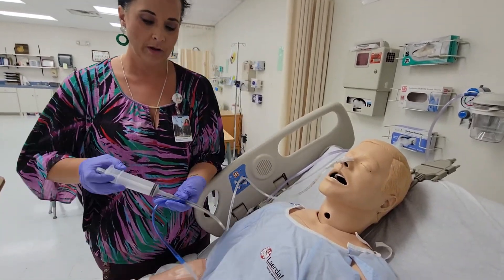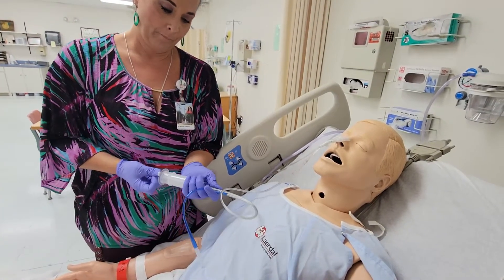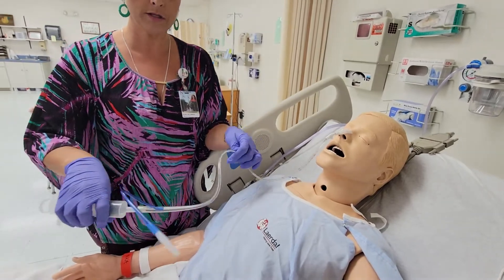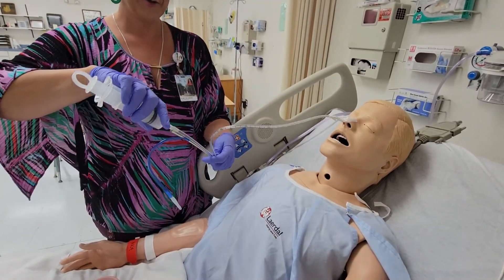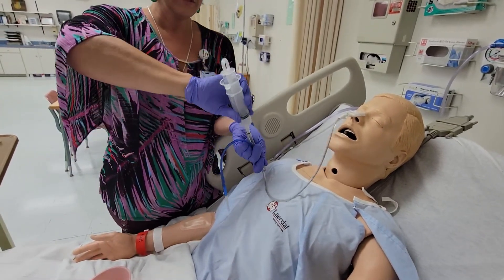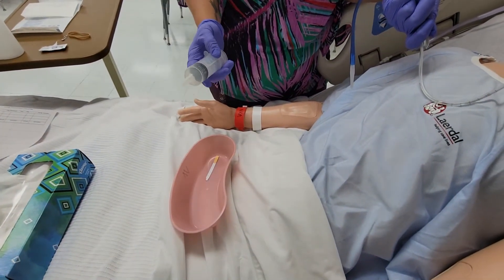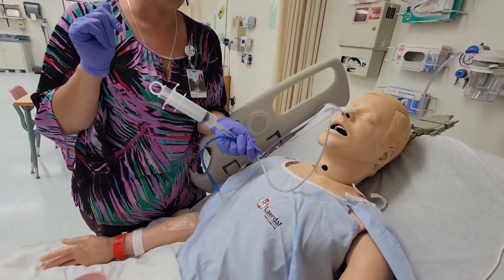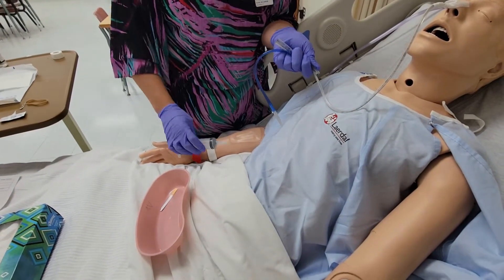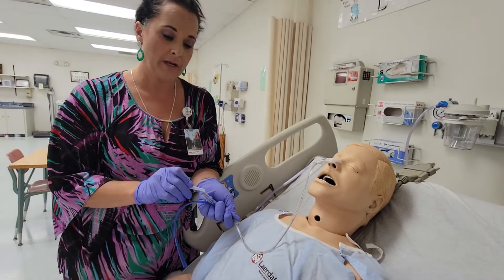We are closed off so nothing's going to come out. You have to verify placement — gently pull back on the syringe and some stomach contents will come into your syringe and down the tube. Always kink your tubing when disconnecting so you're not pulling on your patient. Take the syringe off and put the stomach contents onto the pH paper. The other way you check for placement is with an x-ray.